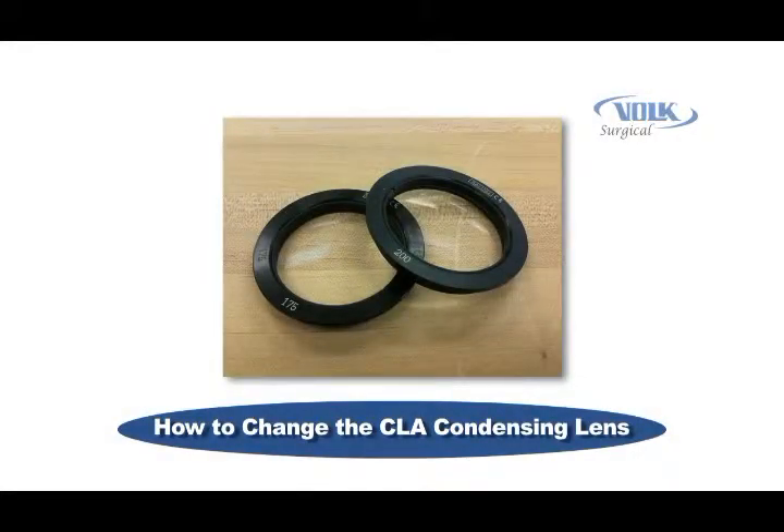This video discusses how to change a CLA condensing lens. It will explain the simple procedure involved in replacing the condensing lens for the Merlin CLA.